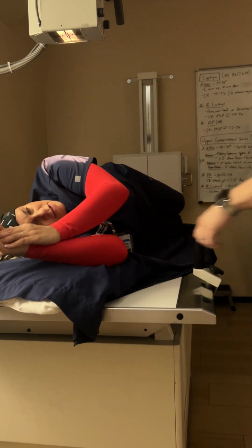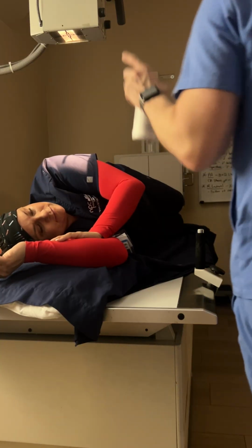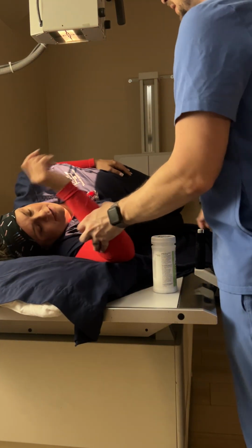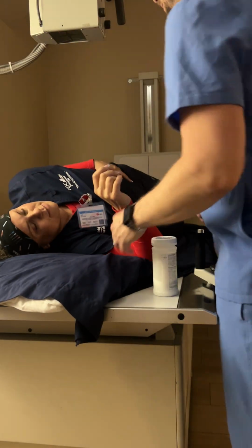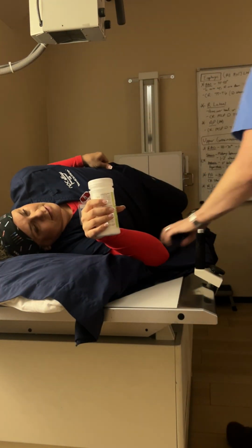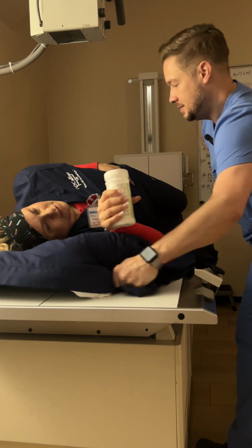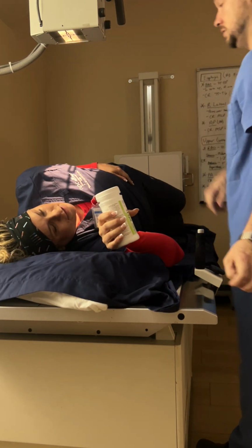Yeah, this is kind of odd to drink. Or alternatively, if it's easier, they can bring this arm behind and then rotate back slightly. Oh, that's better. And then they can hold the barium in this hand and then take a sip like that, okay? This is called like a swimmer's-ish position, okay? Very technical terms, TJ.